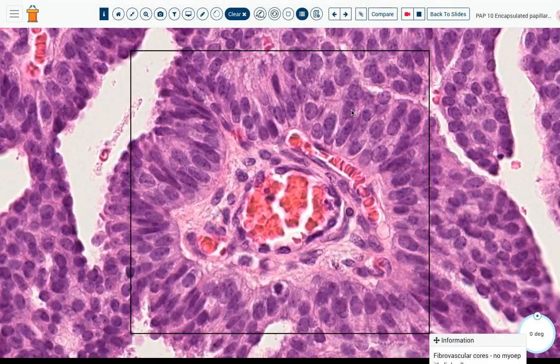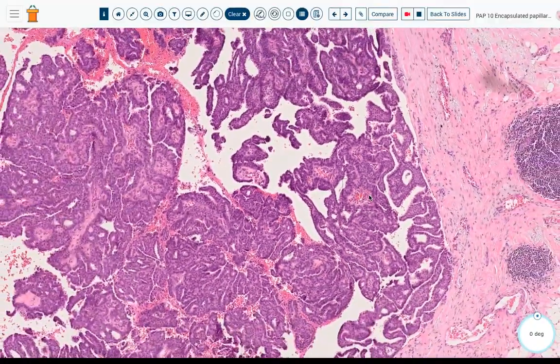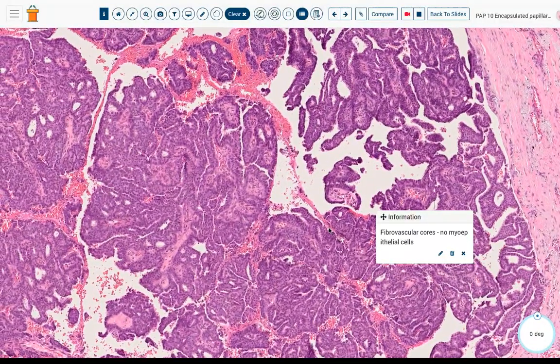If we look in a fibrovascular core, so here's a true papilla because here's stroma, here are vessels. And if you look at the base of the cells, there are no myoepithelial cells here. Again, normally you would do immunohistochemical studies to prove that there are no myoepithelial cells here. A pitfall is that these vessels can closely oppose the basal portion of the cells, so you don't want to do one of the muscle markers for myoepithelial cells and mistake these endothelial cells as myoepithelial cells. So in this setting, p63 is a much more helpful marker for determining that no myoepithelial cells are present.